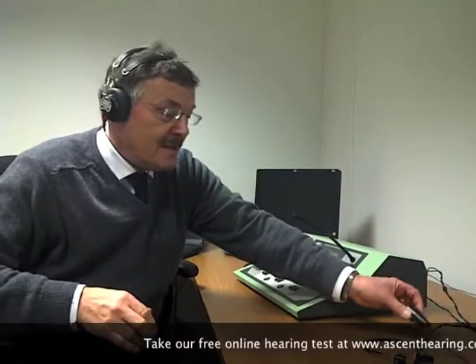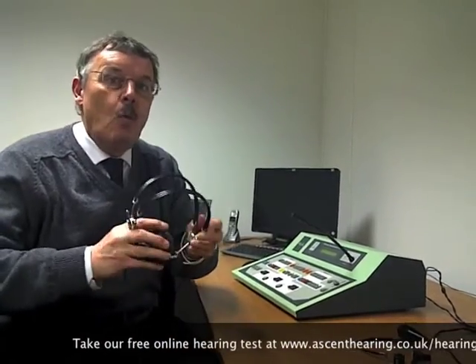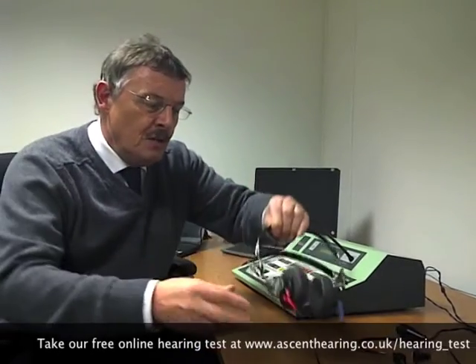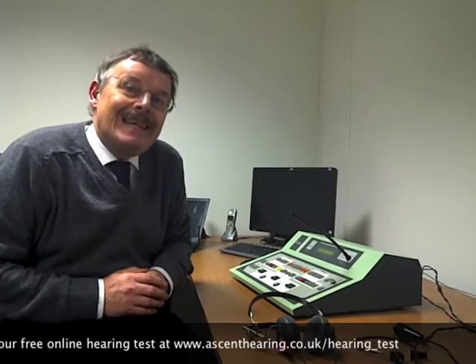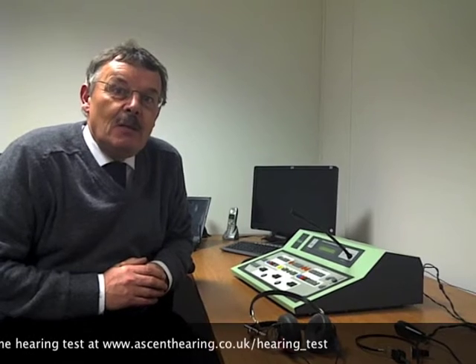It's a very quick test, and as I say, it's done at one level. So what you're doing is you're setting a level of screening, normally about 20 decibels above what is considered to be normal, and you're checking whether the client can hear at that level. If they can, across those test frequencies, they're considered to be within normal limits for hearing and no problem at all.